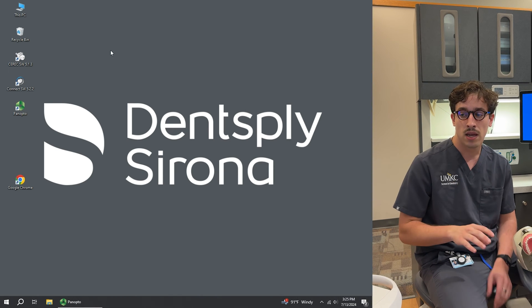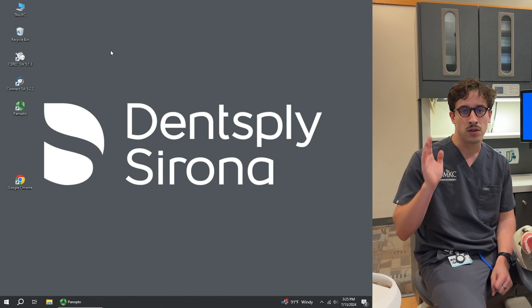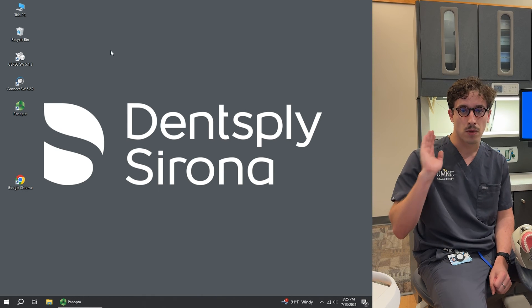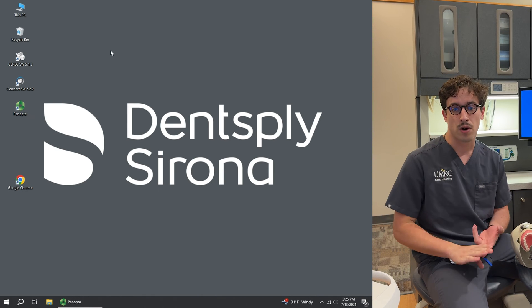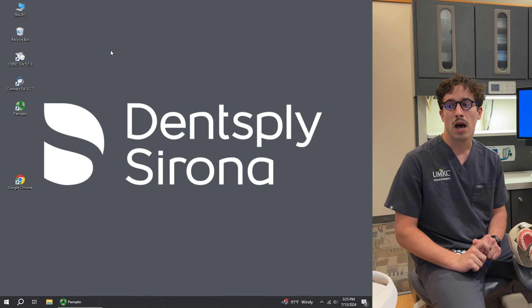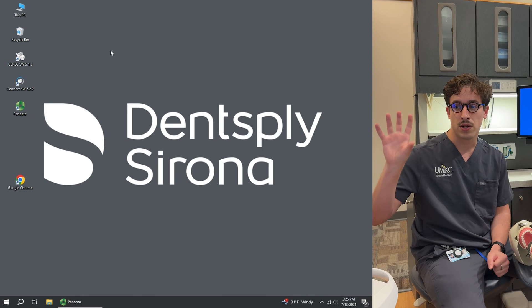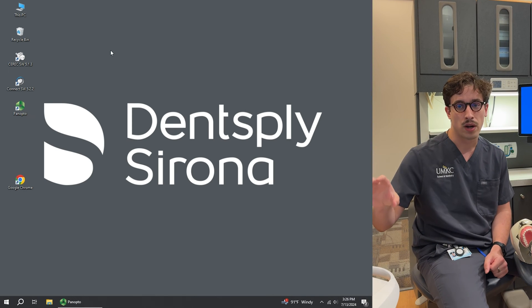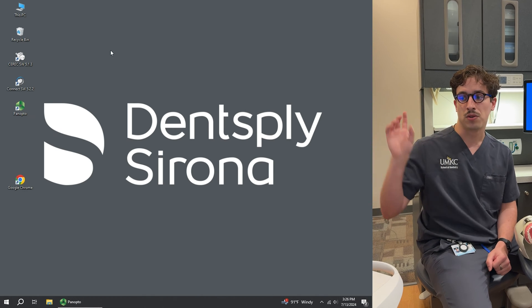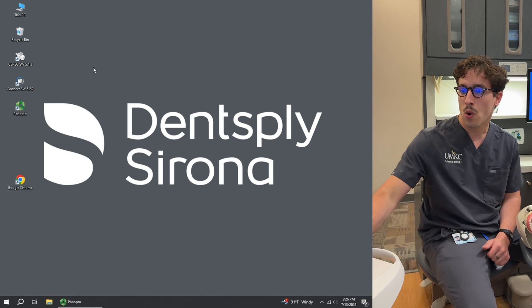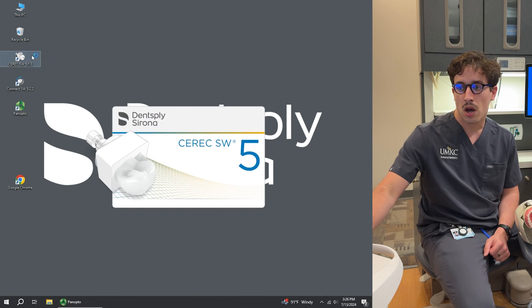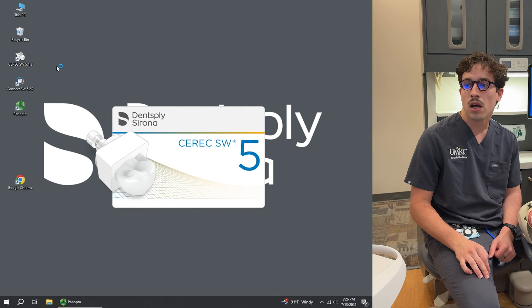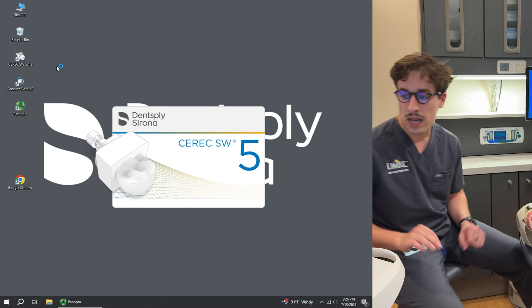So today the workflow for all of them is the same. Connect, you go all the way up through defining your margin. So you'll scan, define your margin, and then send it off to the lab. But today we're going to be going through and doing it with our milling software here to mill it in-house over in our lab. So we're going to go ahead and open up our software here for our milling it in-house.